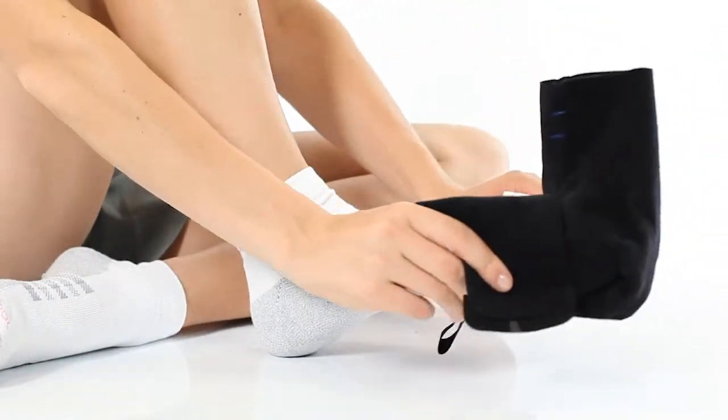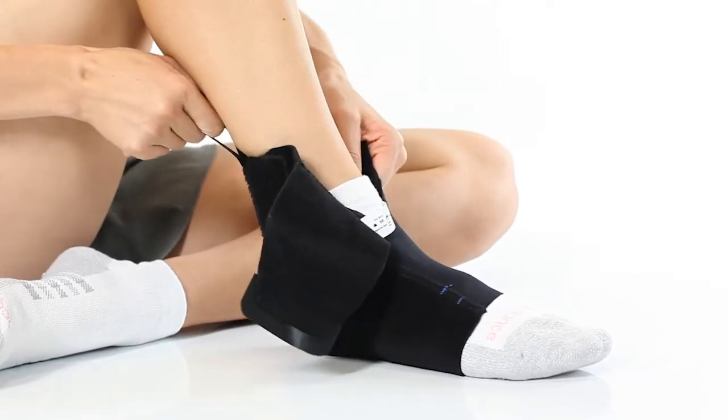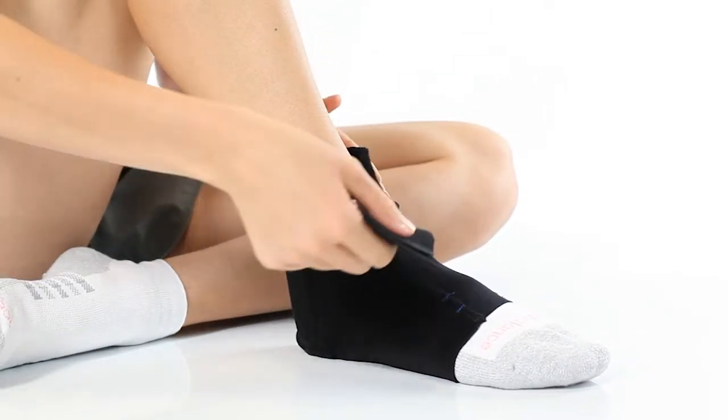Start by pulling the undersleeve on like a sock. Now pull the closure wrap around the front of your ankle and attach.